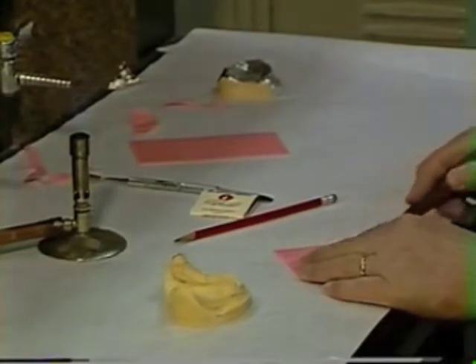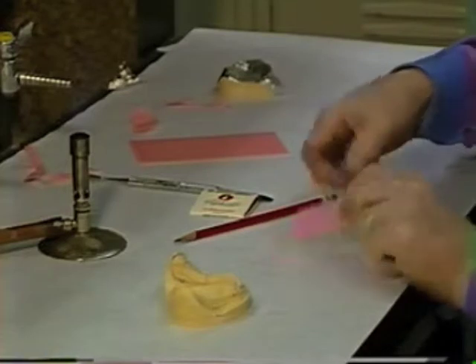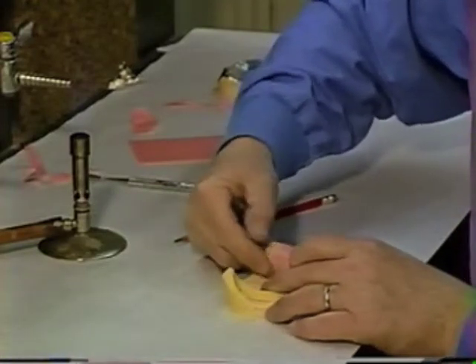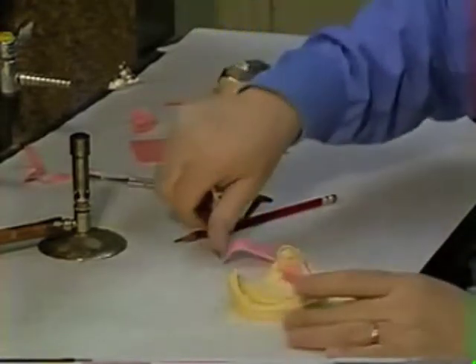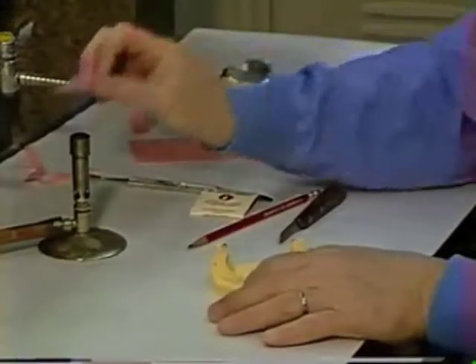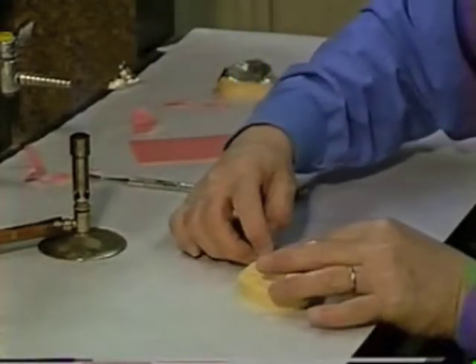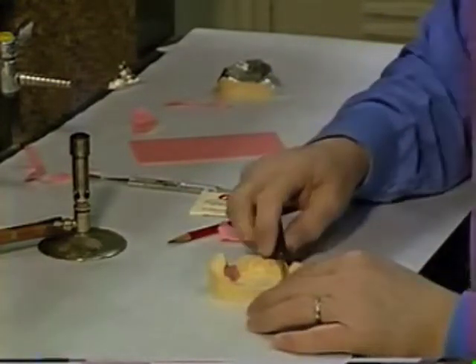And generally it's about 1 inch of width for there. And I'll cut about 1 inch of wax off of that and just lay that wax right over the area where we want to adapt it, like so, and cut it off at the crest of the ridge, about like so. We're going to do the same on the other side. That gives us 1 extra layer of base plate wax now of relief in the area of the mylohyoid line.